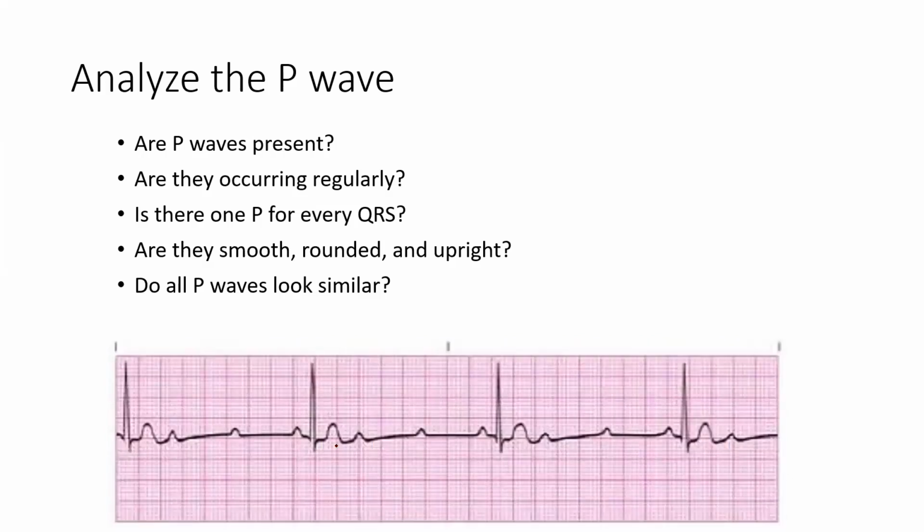All right, for here, let's take a look at this. I think that might be a U wave hanging out there. Not 100% sure. Let's take a look. There's a P wave, but no QRS. There's a P wave and a QRS. So this can either be a P or a T wave, or a U wave or P wave. I'm starting to think it's an extra P wave. So P, no QRS. P, no QRS.